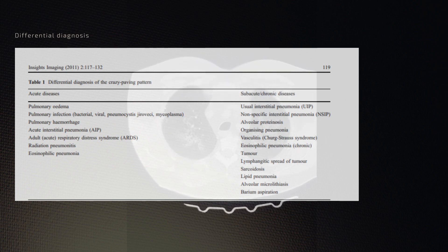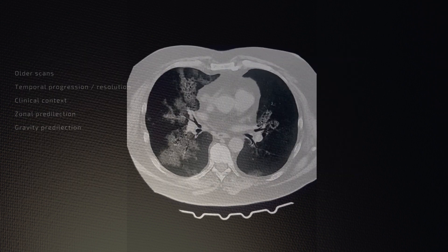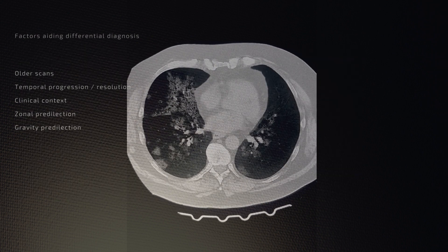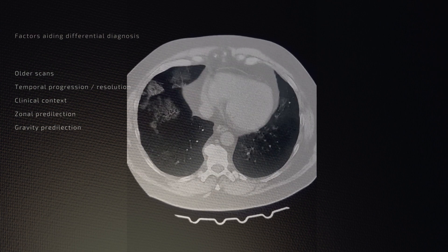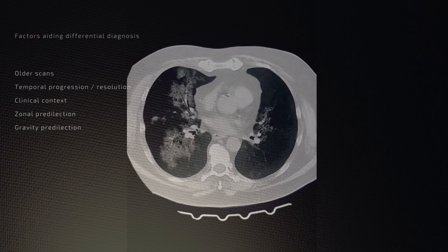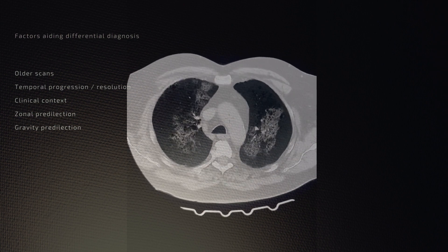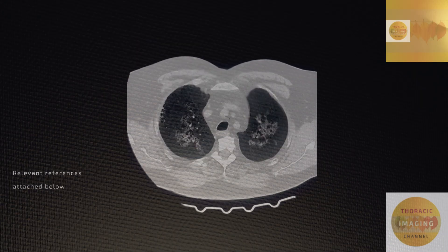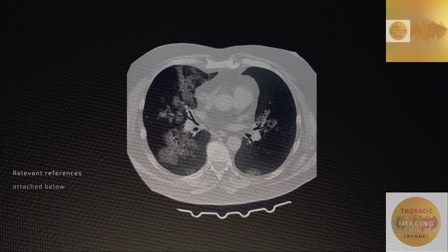The presence of older scans and temporal progression are useful in differentiating, as would be the presence of any gravity-dependent predilection or other ancillary findings. References containing important links have been attached below.